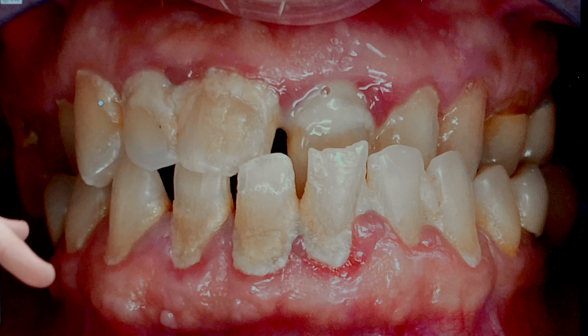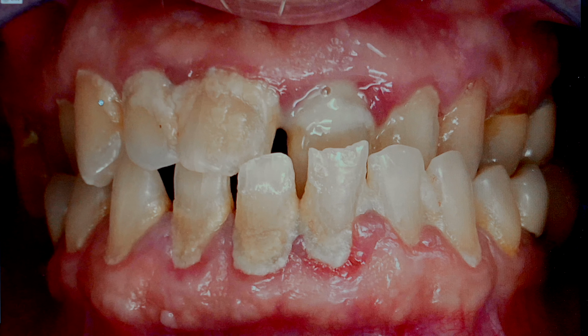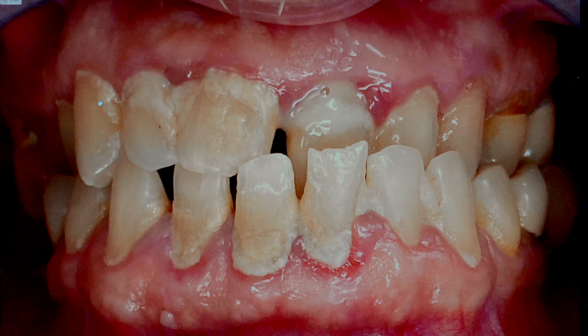Also, you'll notice that the teeth aren't in the greatest shape. There's a lot of gum disease, periodontal disease, mobility of the teeth. And so in this case, we did have to remove all of his natural teeth. He's missing all of his molars on both sides. And so it takes some planning in order to execute on a case like this.